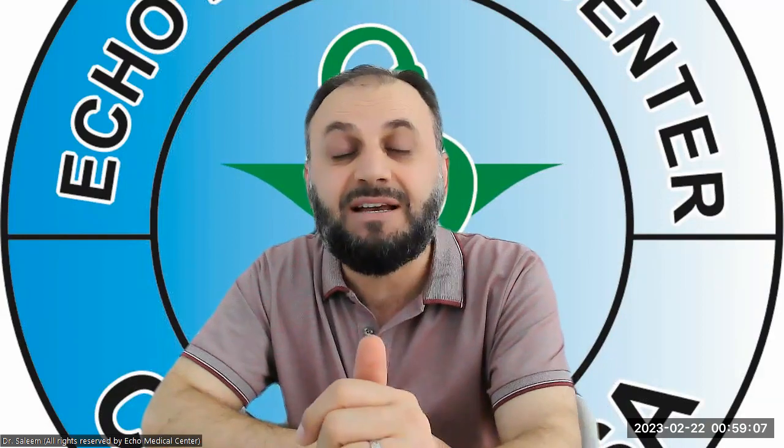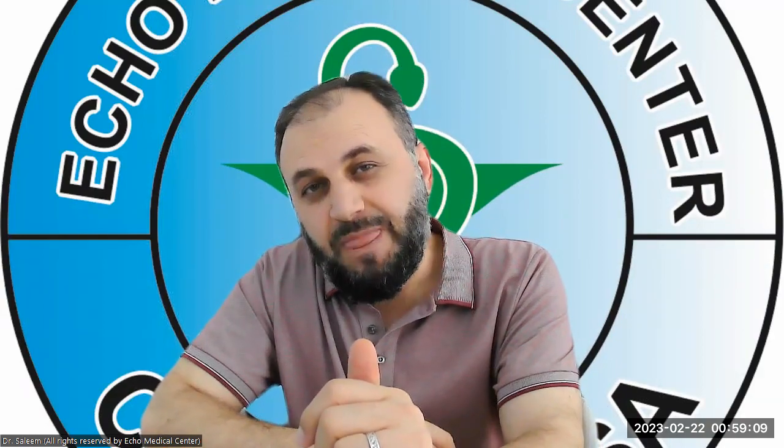Now, the last image we take for this protocol of the cerebrovascular studies, which you can call the CCA protocol, also common carotid artery protocol, is the subclavian artery. We all understand this is a peripheral artery, not cerebrovascular. Why include subclavian in this protocol?